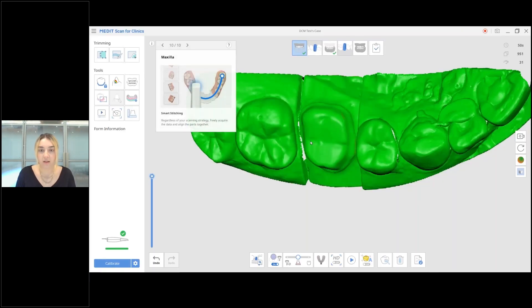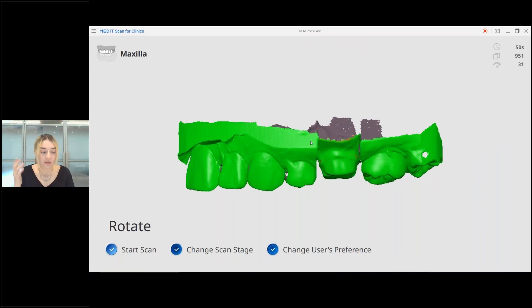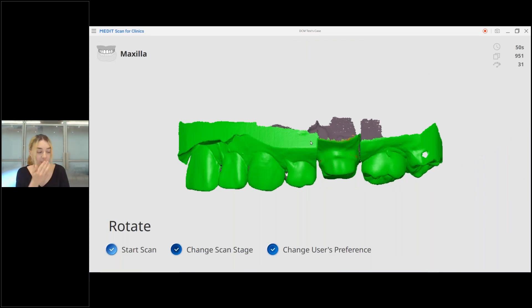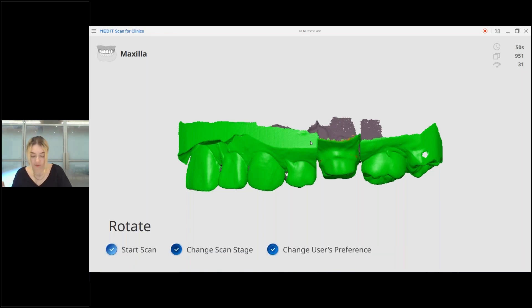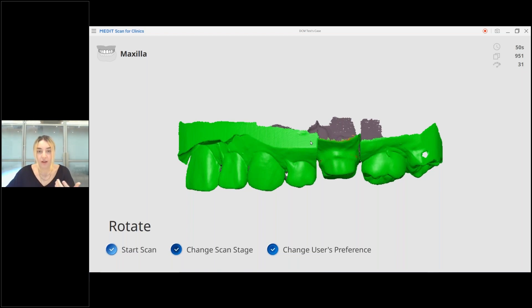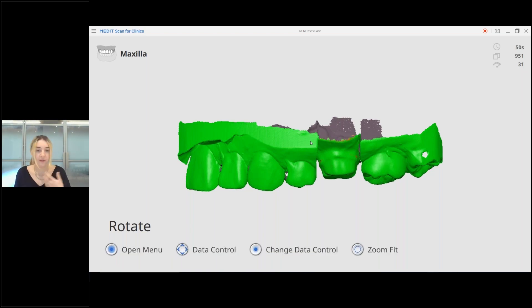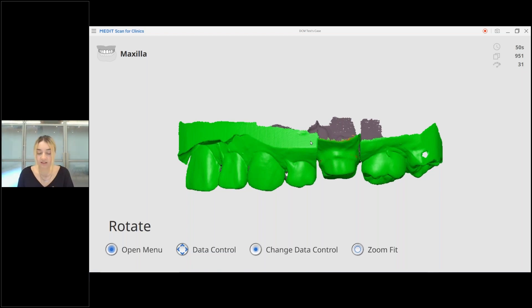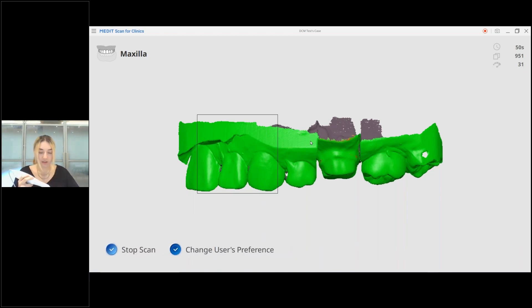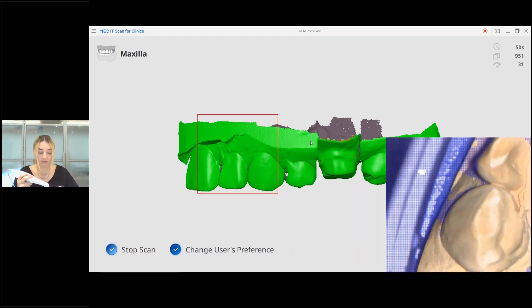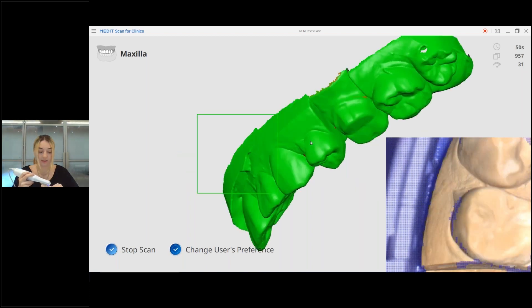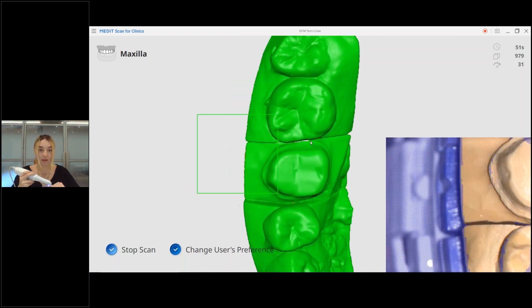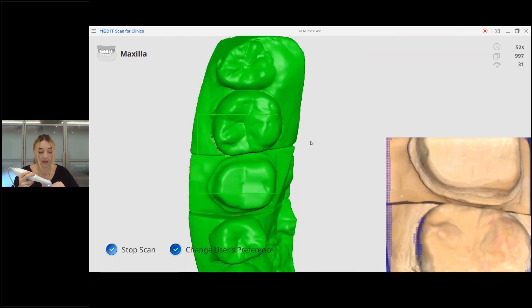Actually it takes you less time to scan, at least from my experience, if you increase scan depth when you scan prep teeth. I did an additional scan just like this. I think that it's also good that last time when we talked about i700 I mentioned remote control mode, and here it is. It's a really nice tool as we talked about last time if you're really new to digital dentistry and you feel a little bit overwhelmed by all the functions and all the UI, you can scan just like this so you don't need to see anything else.